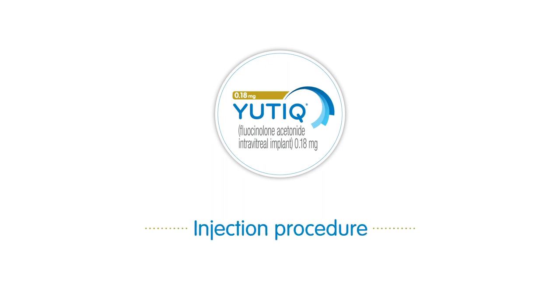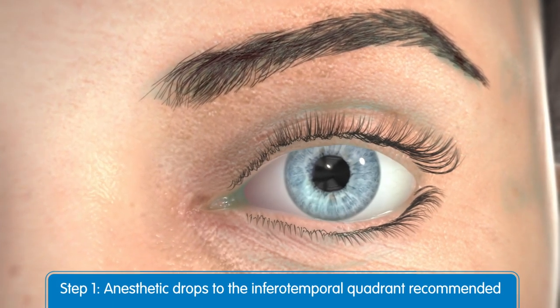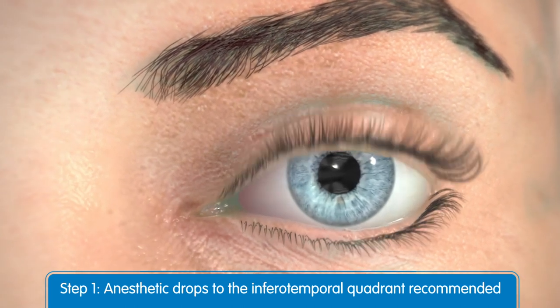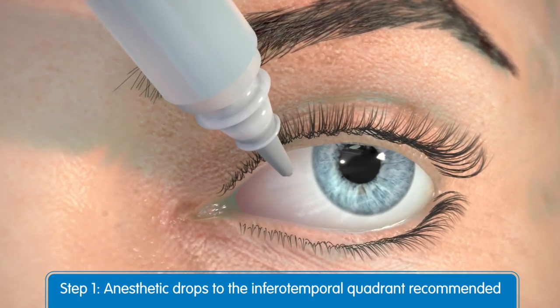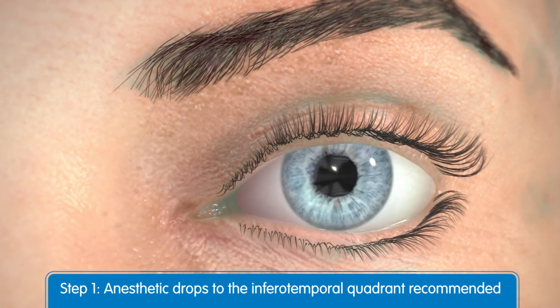Now we'll review step-by-step instructions for proper Utique injection. Just prior to injection, administer topical and/or subconjunctival anesthesia at the injection site. The inferotemporal quadrant area is recommended.